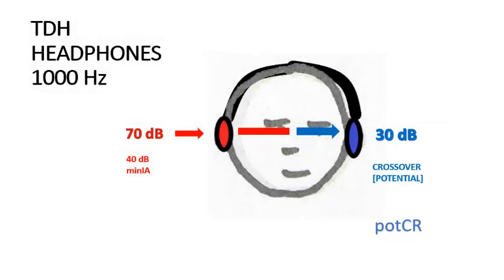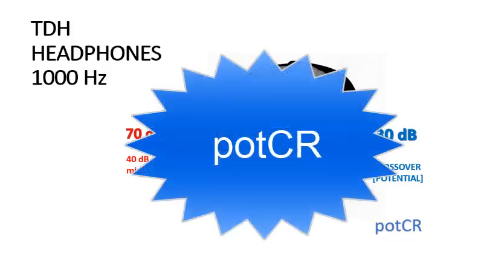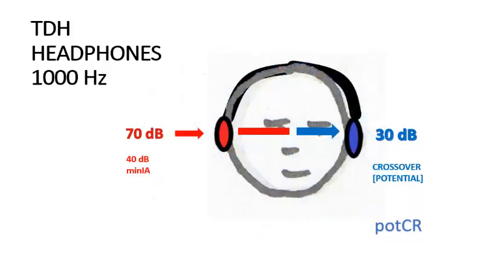For audiometry, we may not know a specific attenuation for every person, but we do know the minimum possible attenuation situation for that particular device and that particular frequency of the tone. So we can predict how much sound might cross to the other side. This is an important process in deciding when masking is necessary.